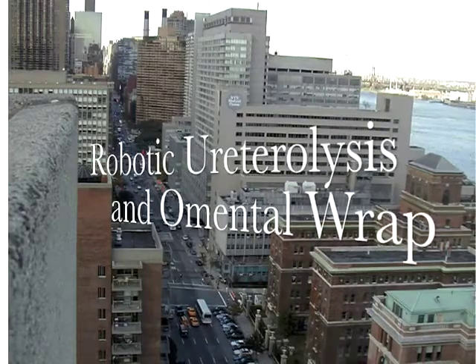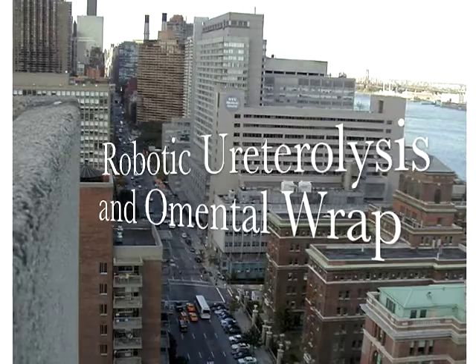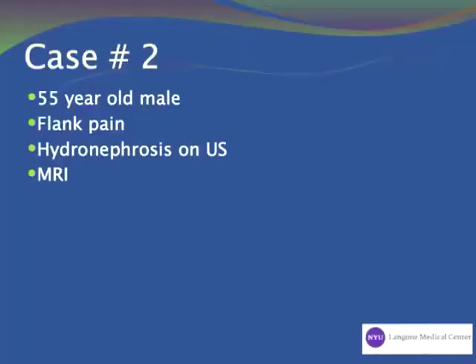This video will illustrate a robotic ureterolysis and omental wrap. The case is of a 55-year-old male with flank pain who was known to have hydronephrosis on an ultrasound.